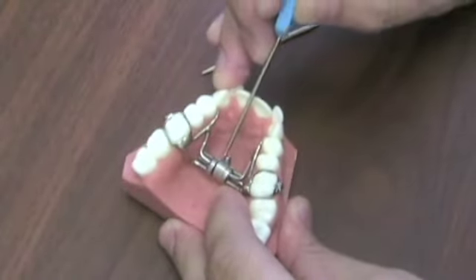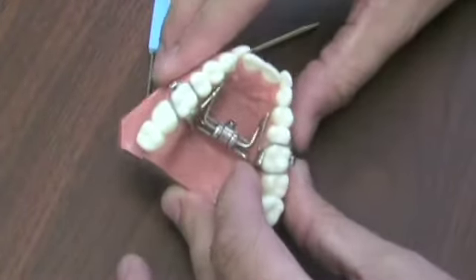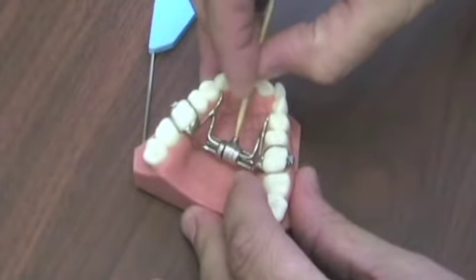If you find it hard to place the key into the screw head, check to see if your screw head is free of food debris. A toothpick is a good tool for cleaning out any residual food in the screw head.